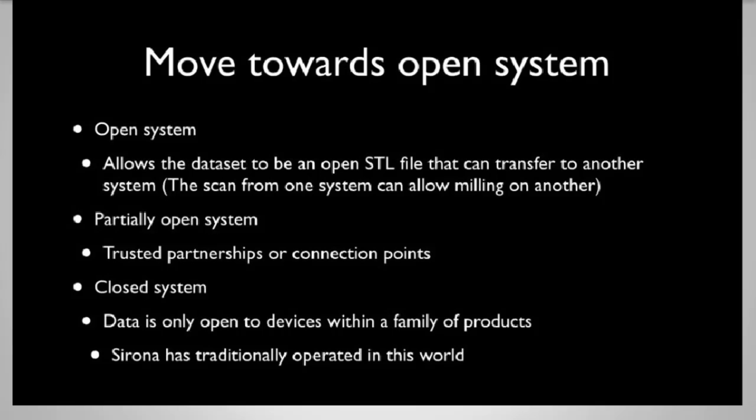An open platform is when you can take your digital impressioning system and that data set, which is traditionally something called an STL file, can be transferred to any other system out there. Meaning you can merge it with other cone beam CTs, you can merge it with milling systems, you can merge it with printing systems. It's a truly open platform. And that's a big benefit, is really freedom.